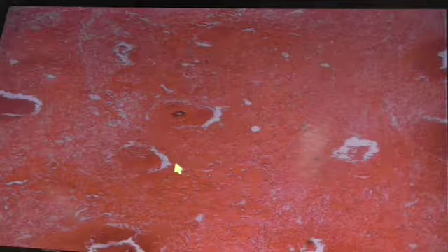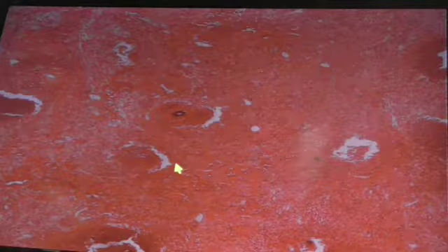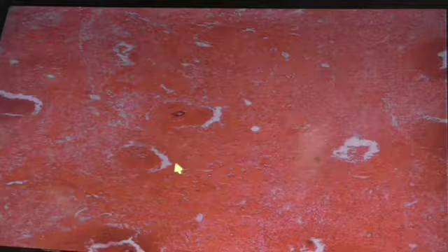Gangrenous would be a form of coagulative necrosis, but you got saprophytic bacteria there invading that dead tissue with gangrene. So it's a form of coagulative necrosis. But liquefactive would be just that. The tissue is liquefied, and you got clear space there, because clear space doesn't take up the stain. Nothing is there because the tissue has been dissolved in that case.